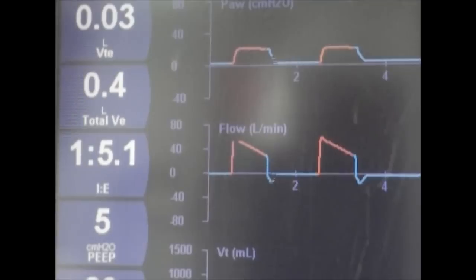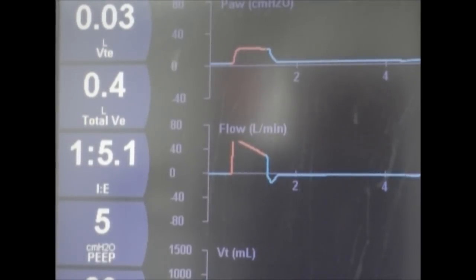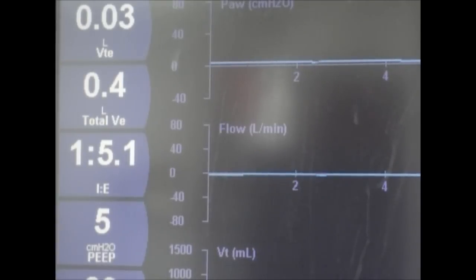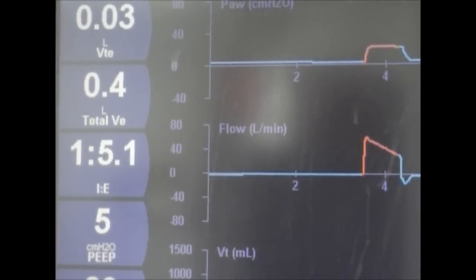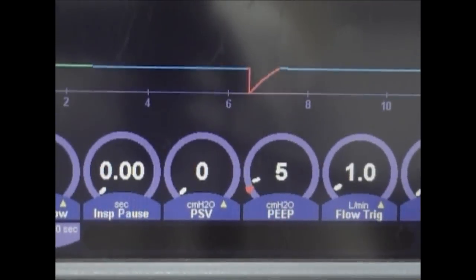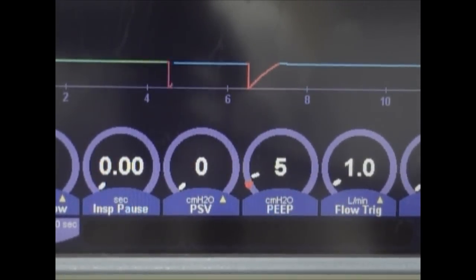When using the speech cannula, we are able to maintain our PEEP level. As you can see, our PEEP is set at 5 centimeters of water pressure, and our baseline is coming back down to 5 centimeters of water pressure. We do not recommend using the speech cannula on patients requiring a PEEP higher than 10 centimeters of water pressure.